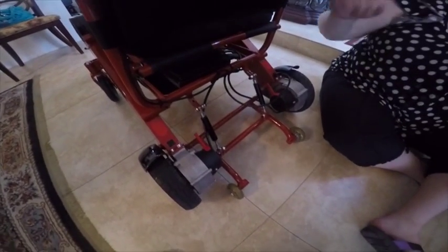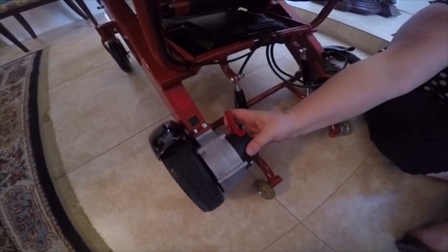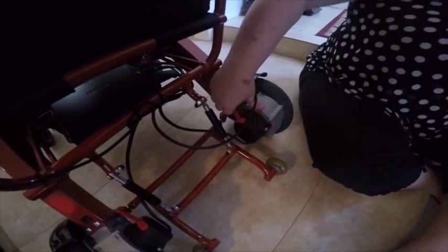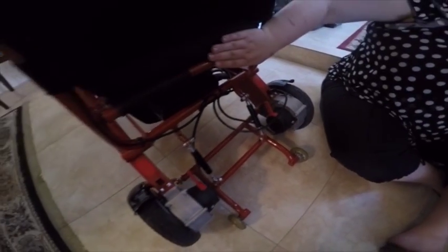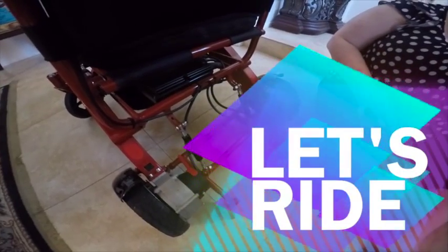Now to turn the engine back on and engage the motor, you're going to take these red levers and pull them back till you hear the snap, and now you'll notice that the wheelchair will not move unless it's powered by the remote. That's it!